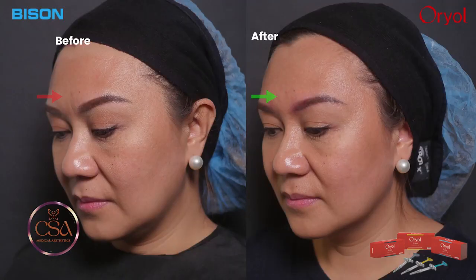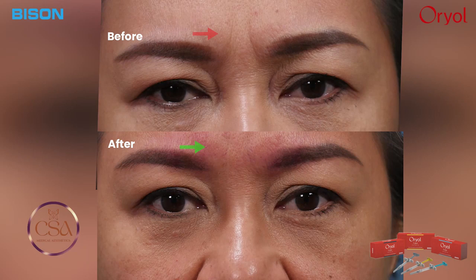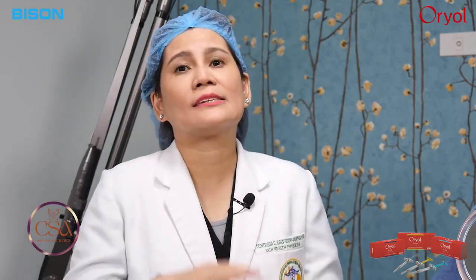Wow. So again, for treatment of static lines, it's not just the toxin injection, because I just want to explain to our viewers that we have 2 types of lines or wrinkles, the dynamic and the static. So the dynamic wrinkle is treated by the toxin. You see the dynamic wrinkle when you move the muscle. The static wrinkle is seen at rest, without moving the muscle. So it's already etched in your skin, and it's treated, at first, with the filler.